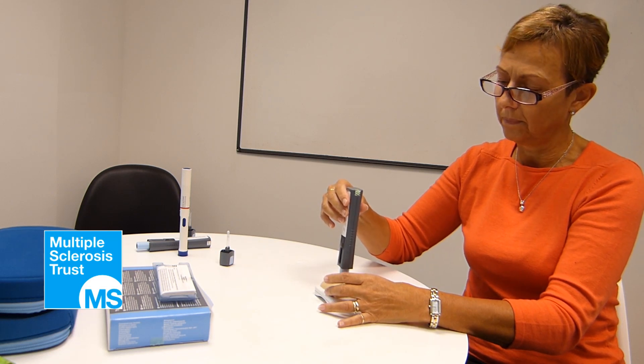Ensure the needle guard is resting flat and flush against the skin. It's important not to push the pen down until you're ready to start the injection.